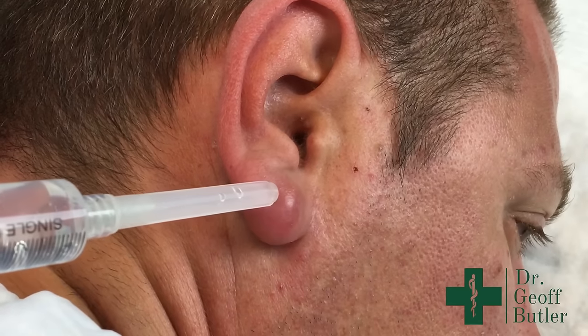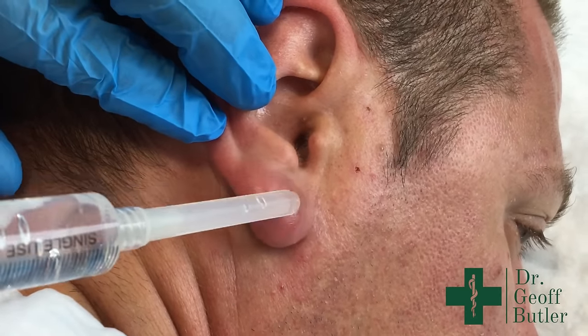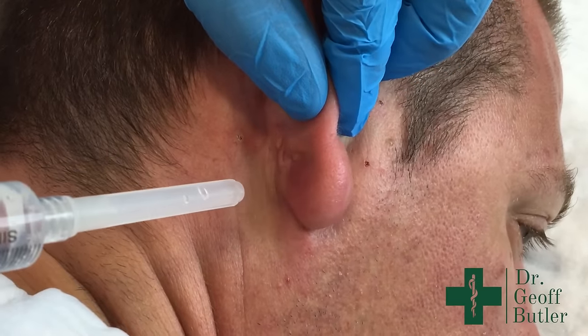The trick here is doing this so you have as good a cosmetic result as possible. Typically I'd avoid the front of it and incise along the back so it'll heal nicer for us.